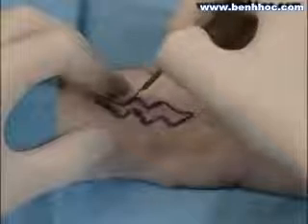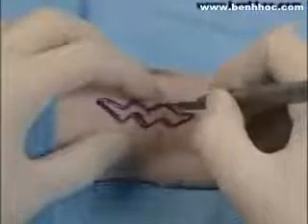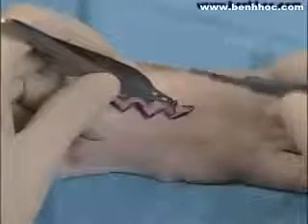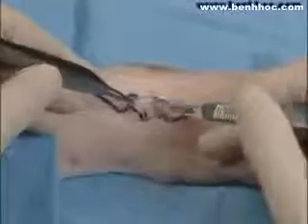The limbs of these W-plasty should not be any greater than 5 to 7 millimeters in length. The angles you can see are not less than 90 degrees. They're broader than 90 degrees usually, or at least 90 degrees. Now we're dissecting the W-plasty by elevating the skin that's going to be removed, which would be the site of the scar. This is a little bit broader than we would use in the human because of the thickness and toughness of the pig skin.